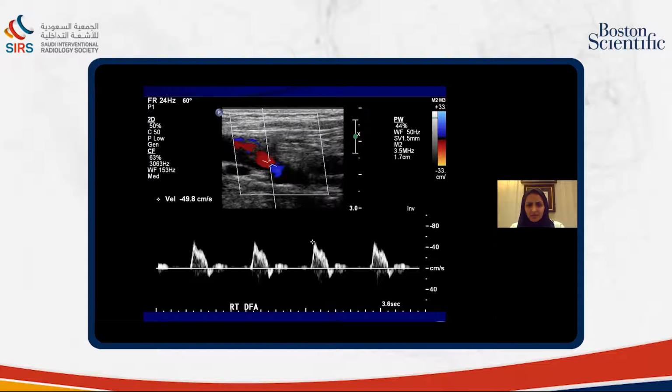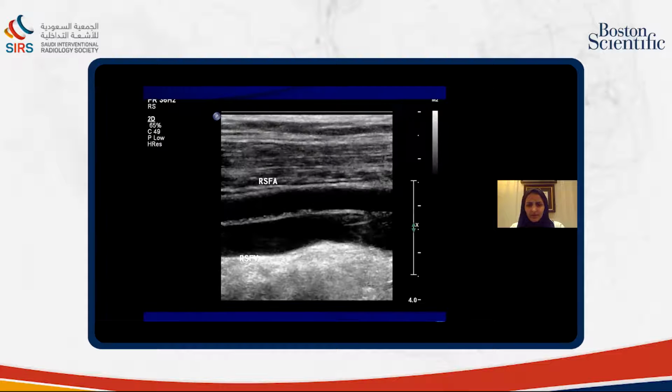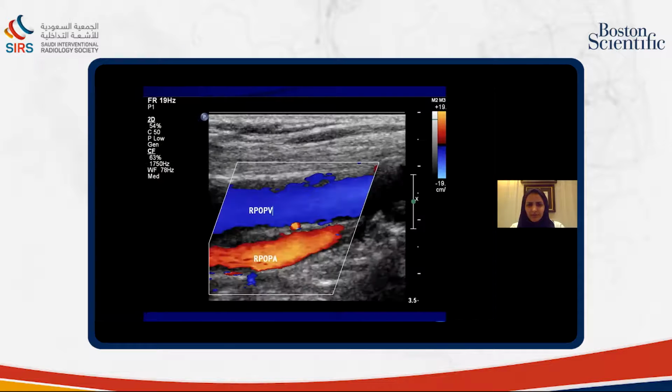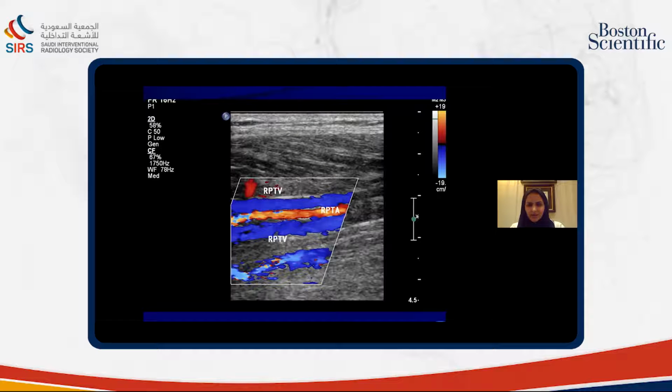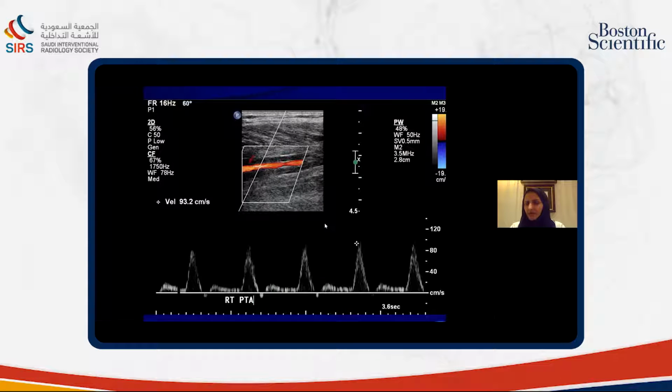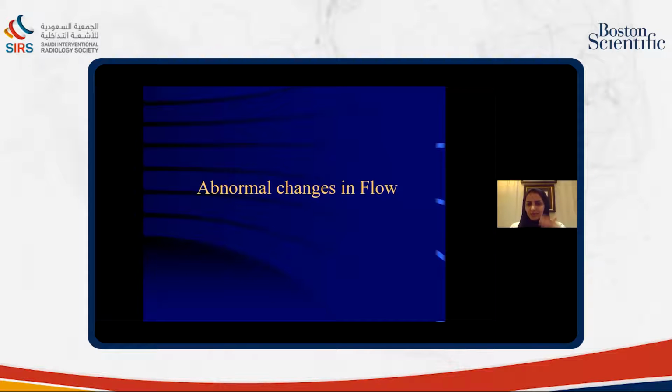Triphasic, and all are triphasic, even the posterior tibial artery, you see it here. Triphasic also, because it's open, there is no occlusion, no stenosis, so we'll have triphasic all the way down.